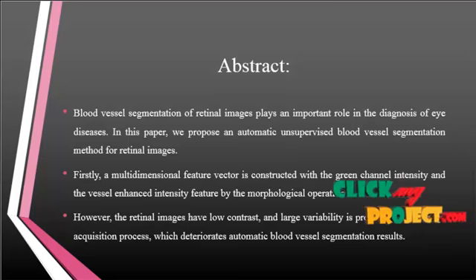However, retinal images have low contrast and poor visibility arising from the image acquisition process. So we have to enhance the image and then segment it.